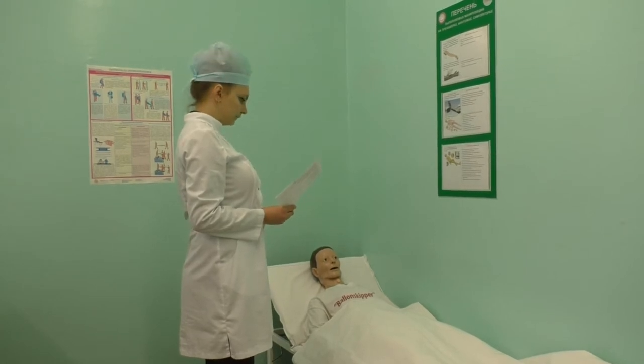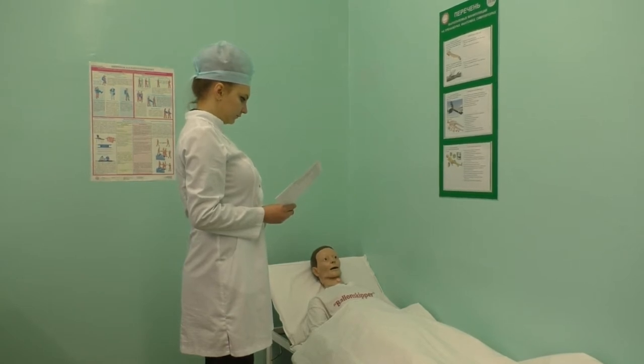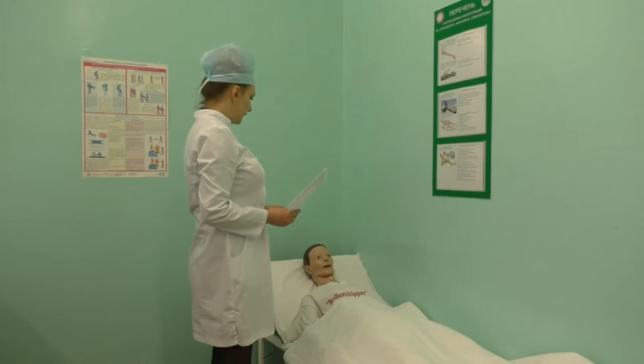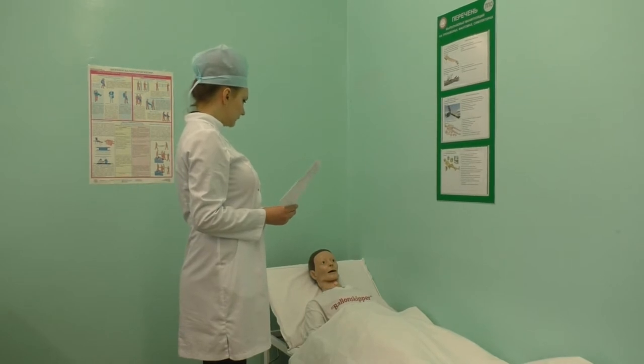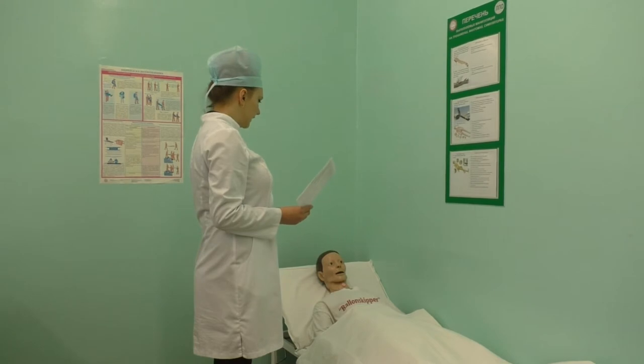Greet your patient warmly and politely, identify your patient, and verify the correct patient using two identifiers. Take an oral informed consent and explain all the steps of the procedure to your patient or family present. Verify the order for manipulation and check there are no contraindications or allergic reactions.